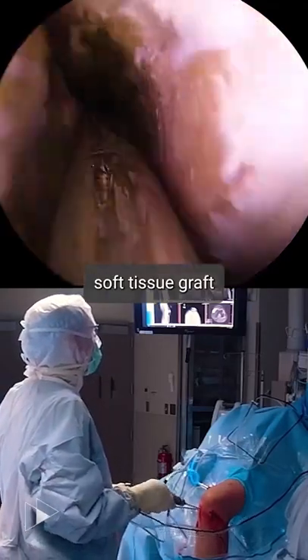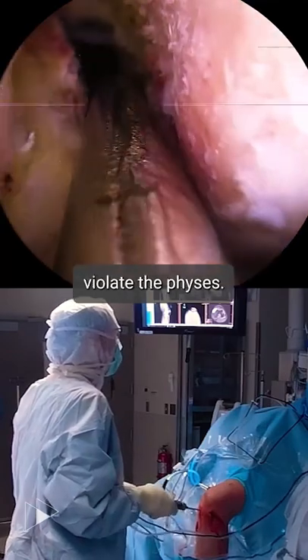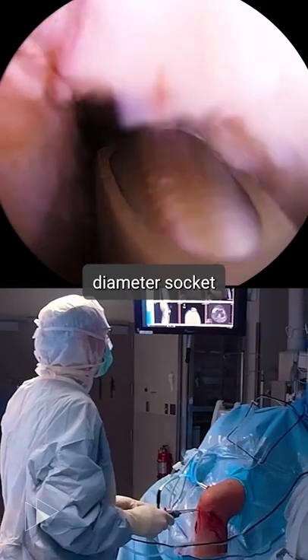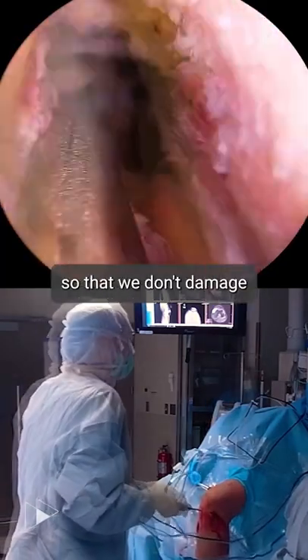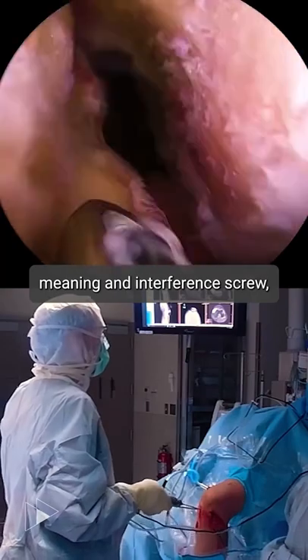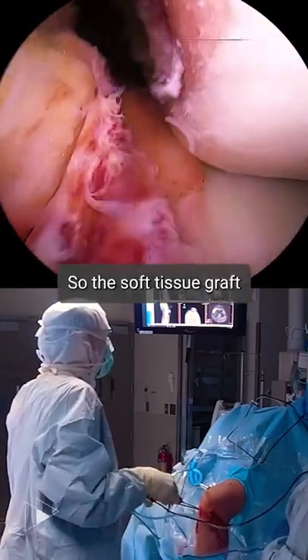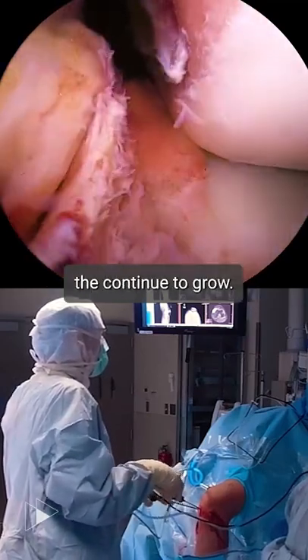We elected to do this soft tissue graft because he's skeletally immature. We're actually going to violate the physis. We're going to use a rather small diameter socket in the femur and a small diameter socket in the tibia so that we don't damage the growth plate and cause growth arrest. We would never put fixation — meaning an interference screw or actual bone — across the physis. So the soft tissue graft through that socket will allow the growth plate to continue to grow.